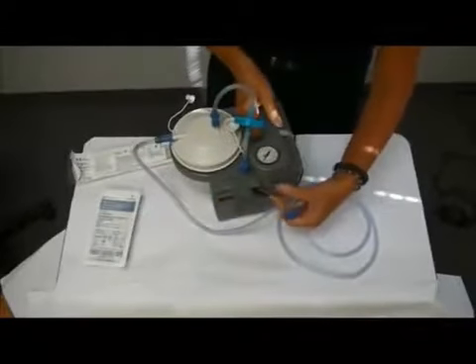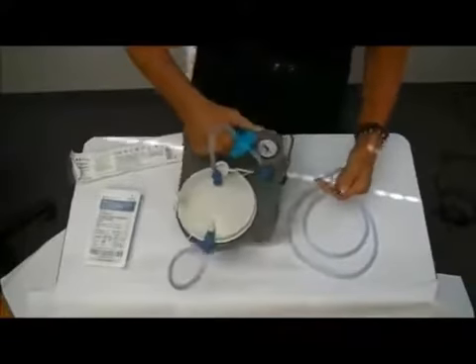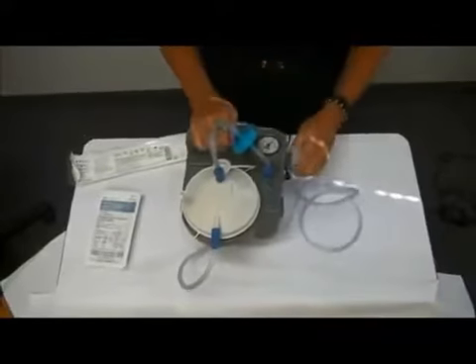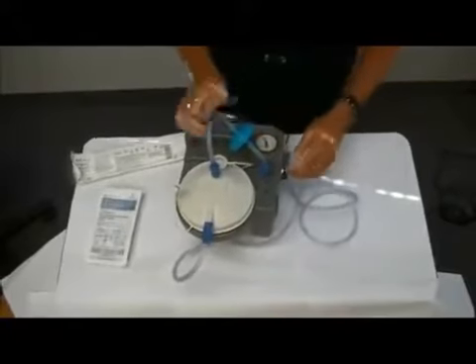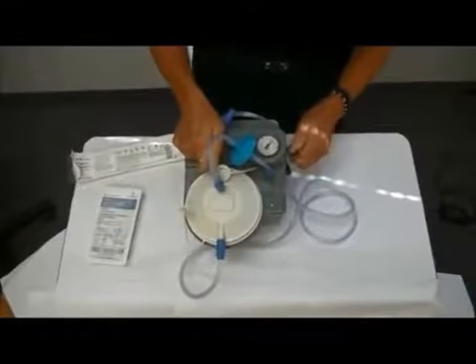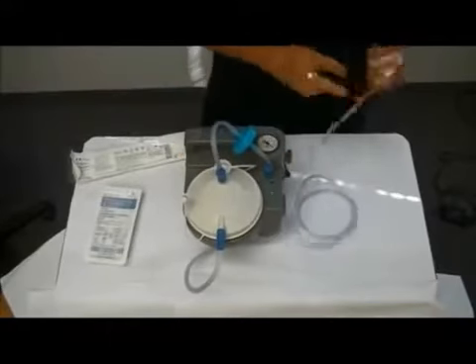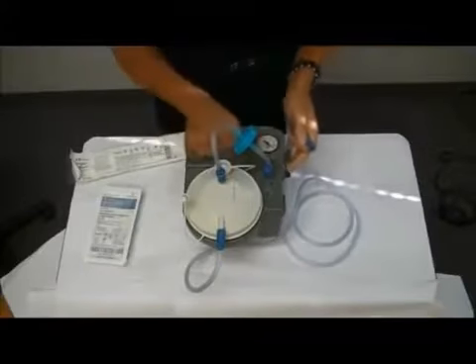Your pressure adjustment knob is also on the side of the suction machine. I'm going to turn the machine on and adjust the pressure to where I want it set. If you leave the hose open without crimping it or covering the end, you won't be able to read your suction pressure.